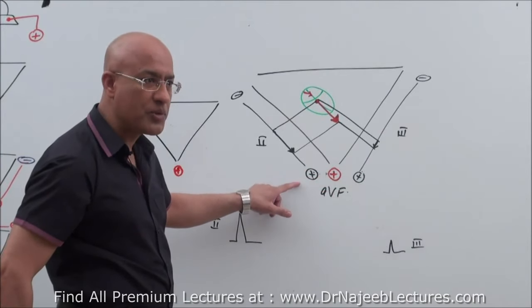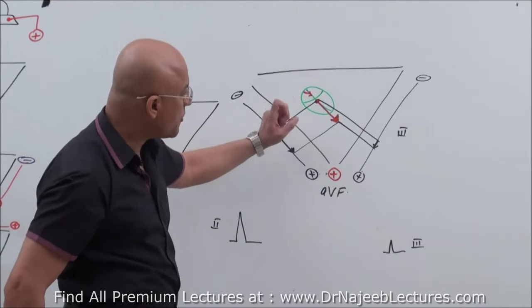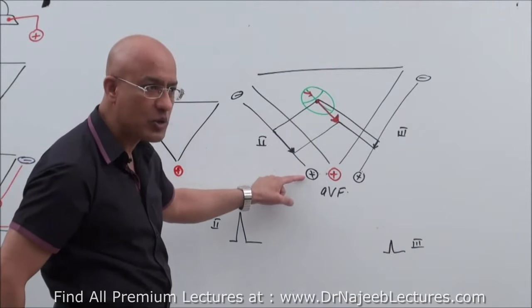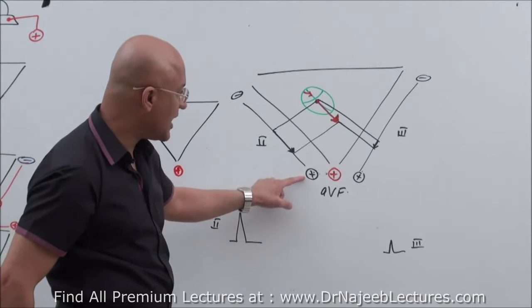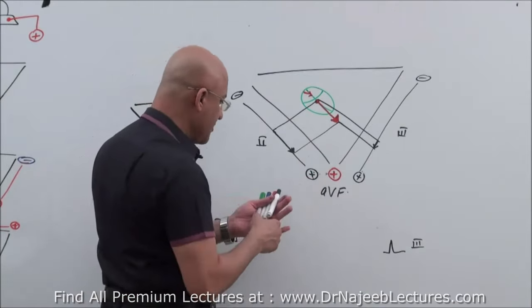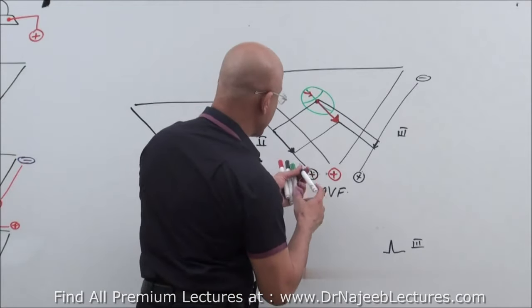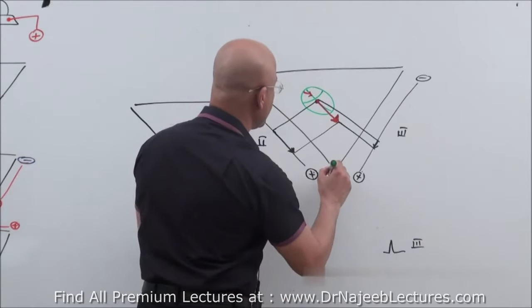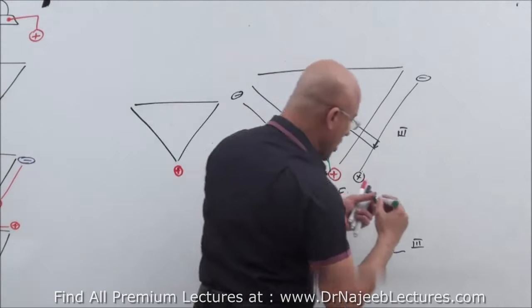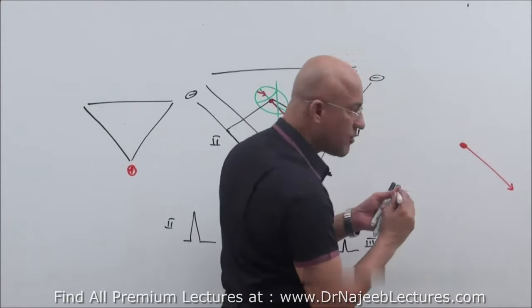It is positioned between lead 2 and 3. If the vector was, for example, perfectly parallel to lead number 2, right? When you move the axis of AVF, now I'm going to draw the axis of AVF. Let's suppose I make the axis of AVF like that. Now I make it here so that it becomes more clear. This is the vector.